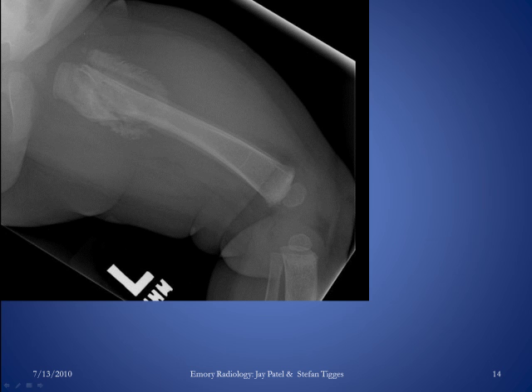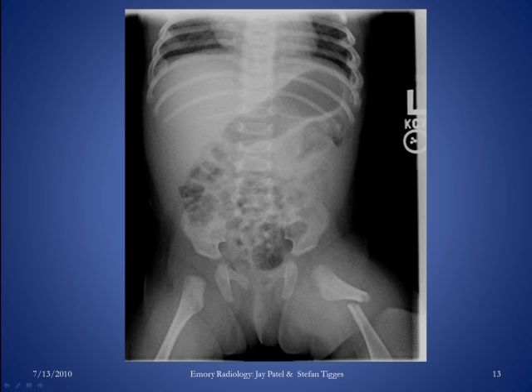Typically when we see fracture lines, if it's a recent injury, it's going to be sharp and well defined, and with healing without immobilization, the fracture lines become sort of indistinct, and there may be blurring about 10 to 14 days out. You usually will start to have callus formation by 10 to 14 days, and it'll peak at 2 to 3 weeks. Hard callus follows, and there's bony remodeling at about 3 months up to 1 year. If the patient is immobilized and that fracture is reduced and put back into normal anatomic alignment, it could basically return totally back to normal.